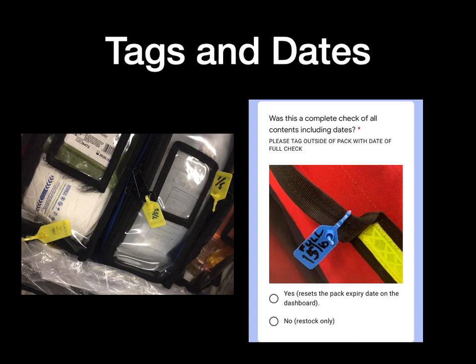If any equipment is found to be unserviceable or missing or has been lost, a cardboard U/S tag should be attached to the bag, and it should be made clear that there is an incomplete set of equipment within. An email should be sent to the equipment officer outlining the issue and any unserviceable equipment isolated from use.